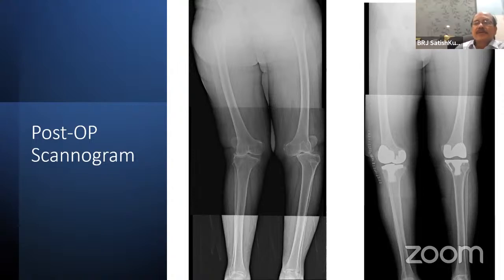That is the remodeling deformity that is seen in dysplastic valgus knees. But in a varus knee, what we generally observe is proximal tibia internal rotation. And now you do the proximal tibial release, you do external rotation, and then you sublux. Naturally, it gets better after the proximal medial release. And you keep the femoral component and tibial component in correct rotational alignment. That corrects the rotational deformity, whatever is there at the joint level.